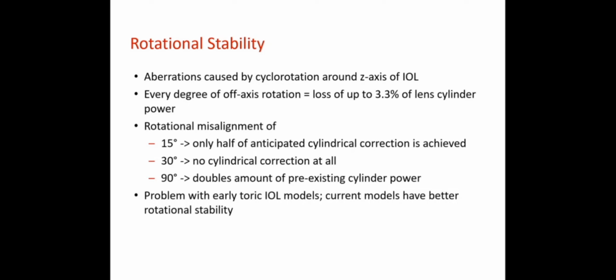You want to look at the total cornea astigmatism to be sure, because like we said, the threshold for cornea astigmatism is 0.75 diopters. So post-operatively, if they can bring the astigmatism down below 0.75 diopters, including posterior and anterior cornea, then that would be good.